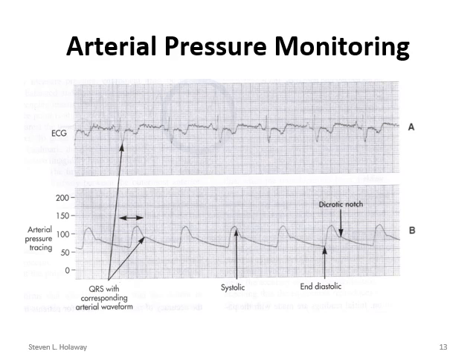So you want to look for a nice rise, a nice peak, back down, the dicrotic notch, then slope down, back up. It should look pretty much that way all the way through. Systolic is measured at the top. On the paper, you can see it actually has numbers.